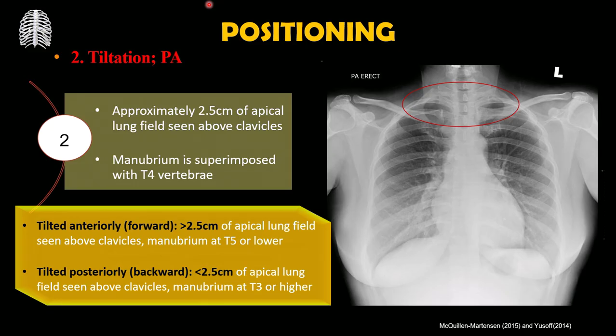In order to improve the positioning of the patient, we need to make sure that the superior mid-coronal plane is parallel to the IR.